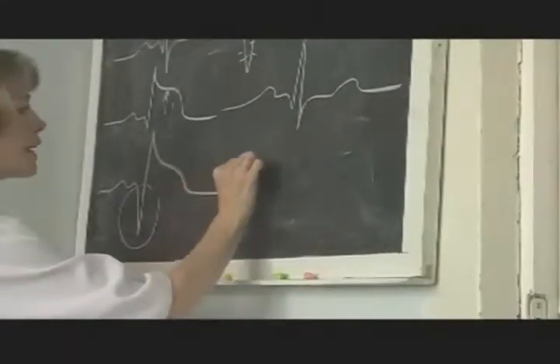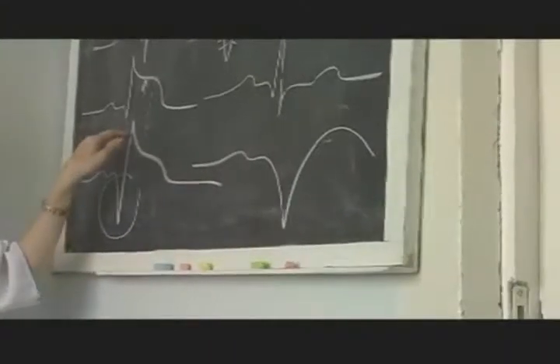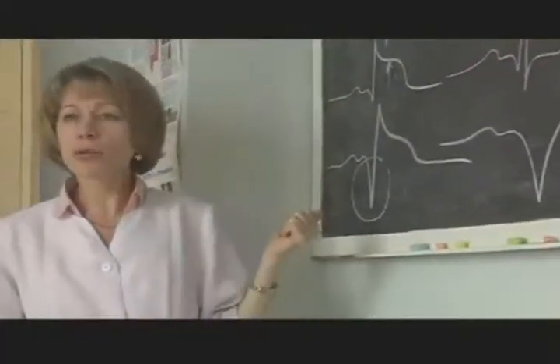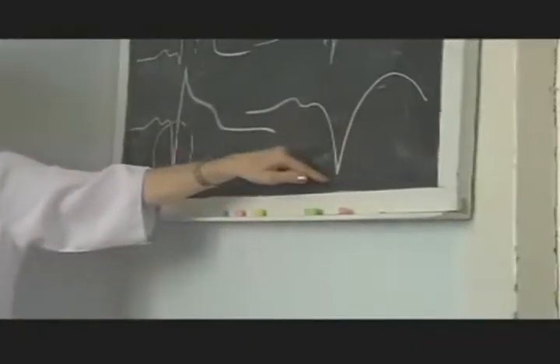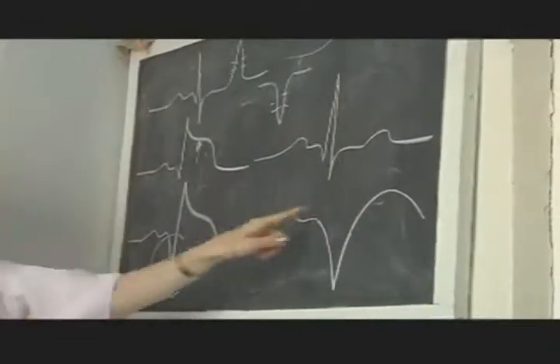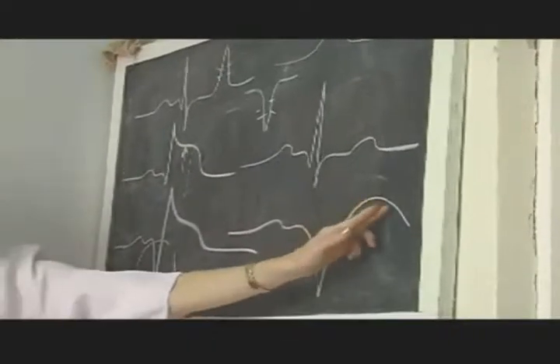ECG will be changed. T wave cannot be seen. R wave is absent. Why? Because the R wave indicates contraction of heart muscle. But if the whole heart muscle is necrotic, how can it contract? It's impossible. The R wave cannot be. Instead, the R wave will be a pathological QS complex. This is both negative Q and S wave. They are connected, and instead of the normal complex we will see a pathological QS complex and a raised ST segment.